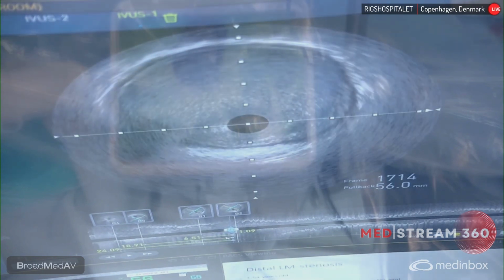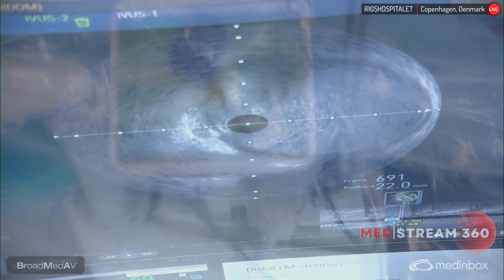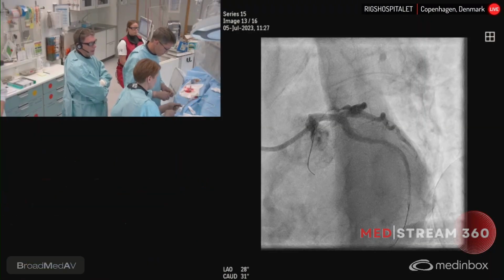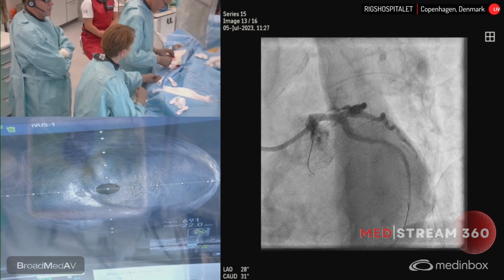Now, I don't think it will change our strategy. If you look, yeah, it looks absolutely good. I don't think you need to do an IVUS. It's a very beautiful ostial circ, actually. So you can do an IVUS in both vessels just to see what you have achieved. So let's do that. So we go with the LAD first, because that's where we dilated, right? Just to see what we achieved with the pre-dilatation balloon, just from an education perspective.